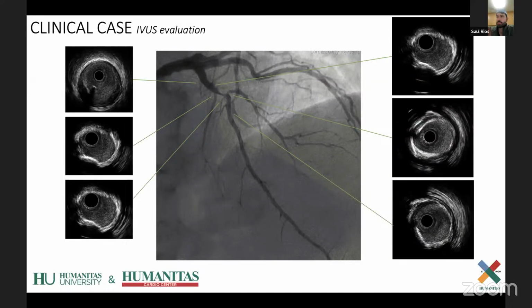If you're having trouble delivering your equipment, even with a guide liner or with a stiff wire, then I think the next option would be Rotablator, because of the extent of the calcium that you have going from the proximal LAD all the way down to the lesion and probably past the lesion as well. So you could get started with a Wolverine, for example. If you have trouble delivering it, or if you have trouble expanding it, then you can upgrade to rotablation.